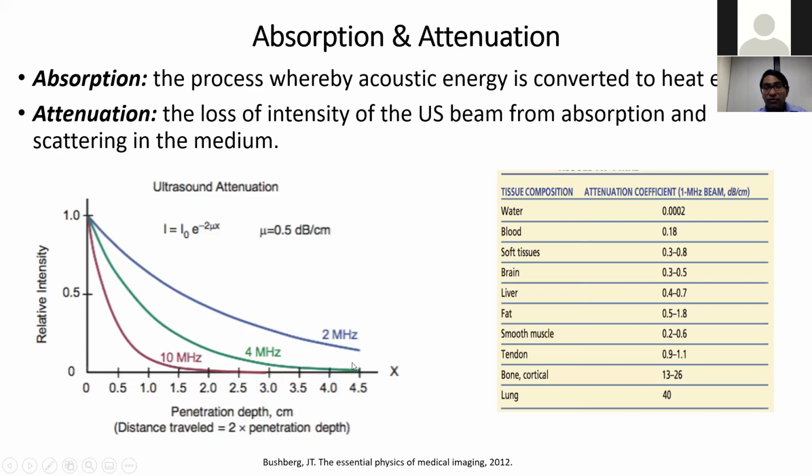That's why we have to use a lower frequency. Frequency is also related to the resolution. So there's a trade-off between resolution and attenuation that we'll discuss later on.